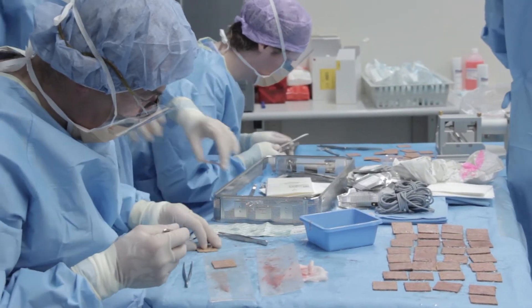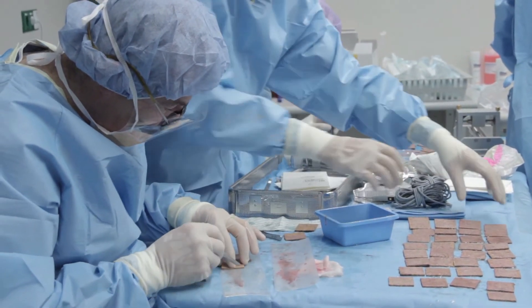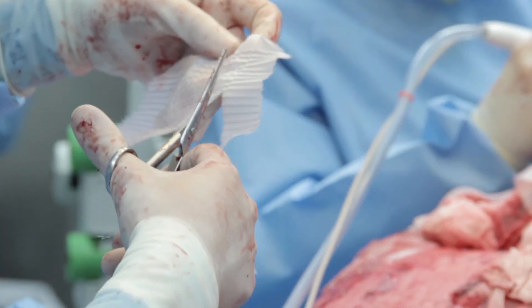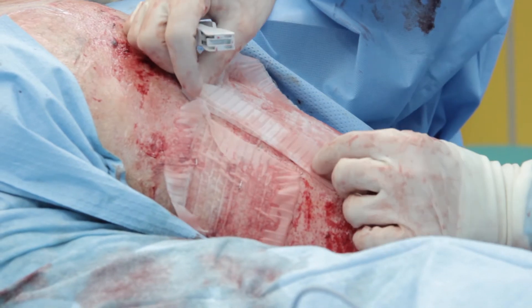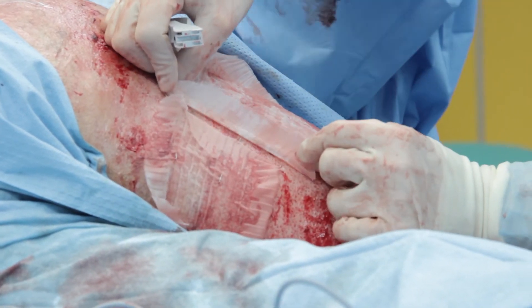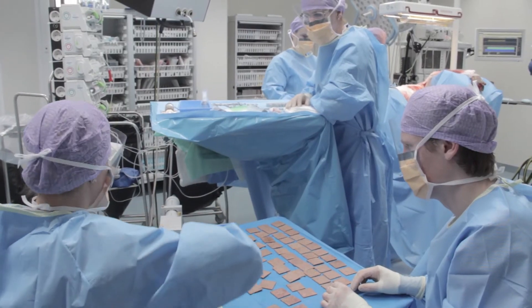The MEEK method is a practical and reliable technique for obtaining widely expanded autografts, especially in case of extensive burns. It is considered the most efficient method for dealing with the patient's skin.